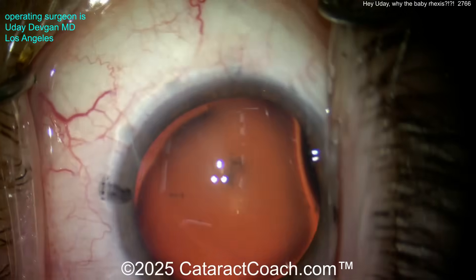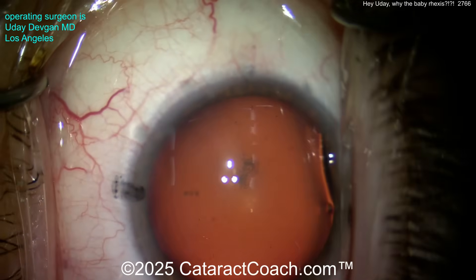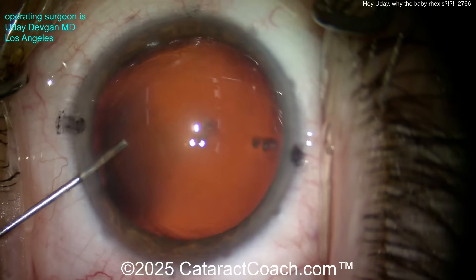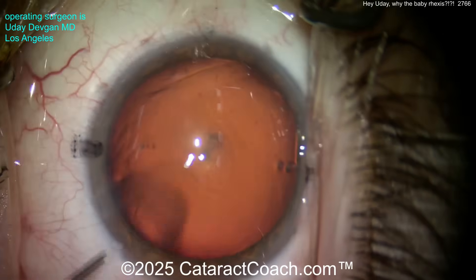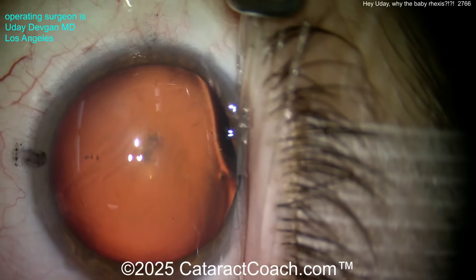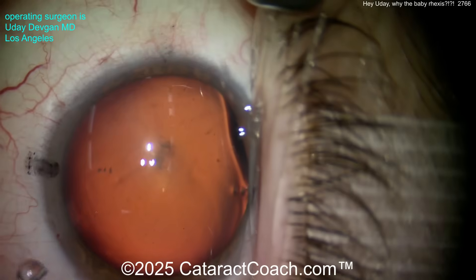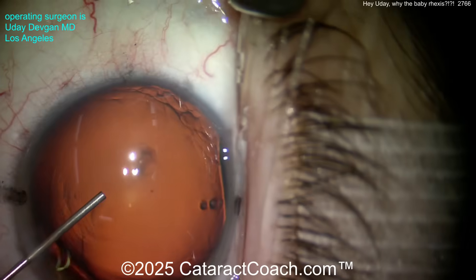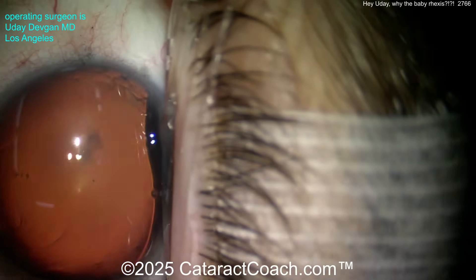Here's the side port. What do you notice about the corneal white-to-white? Look again. We'll put some anesthetic in the eye, some viscoelastic, and then put the fixation ring down. The fixation ring has a diameter of 13.6 millimeters. Here's the viscoelastic — and look, you need a whole syringe to fill it up.